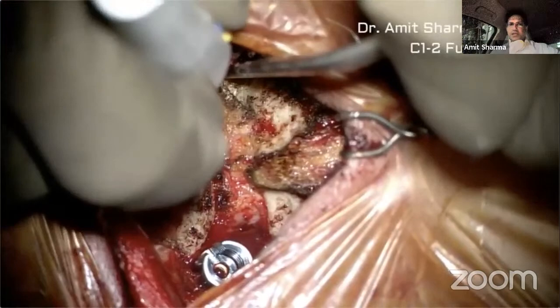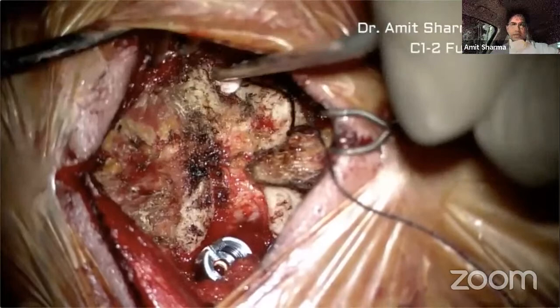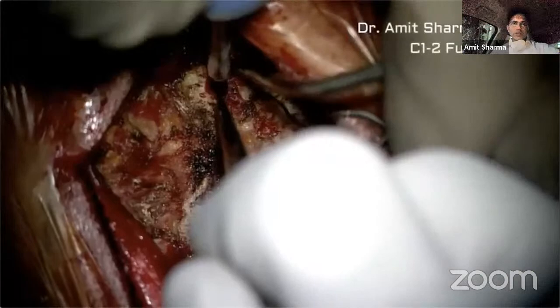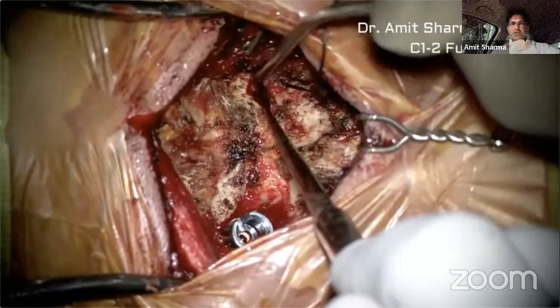So once the other side of the C1 lateral mass is exposed, again with the blunt dissection, as I said, this is an edited video. We encounter a lot of bleeding over here, which you have to just pack with a cottonoid or gel foam or Surgicel. So here we are able to see the C1 lateral mass nicely, and the midpoint of this will be chosen for entry point. Again, we'll check the proximal distal angulation, and about 5 degrees medially, the screw will be inserted.